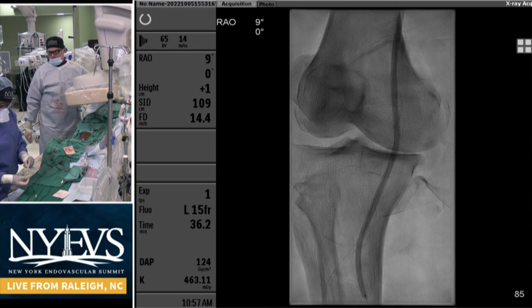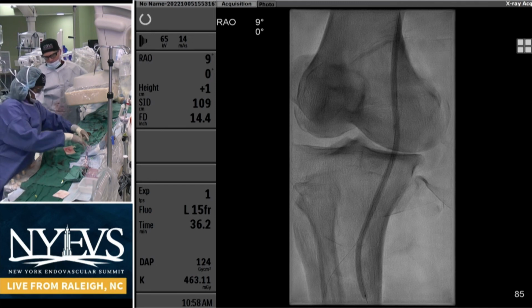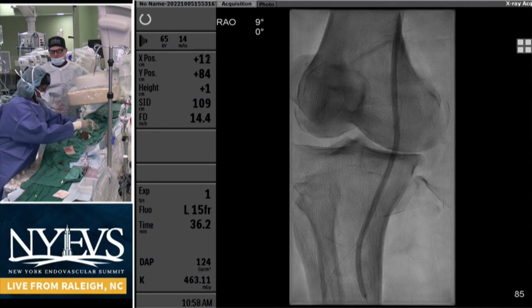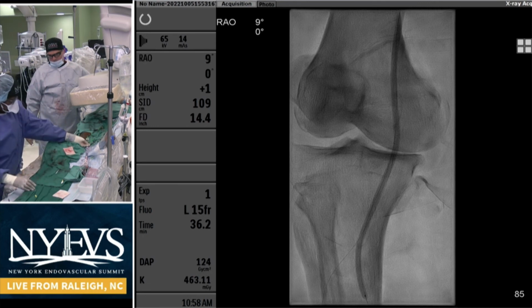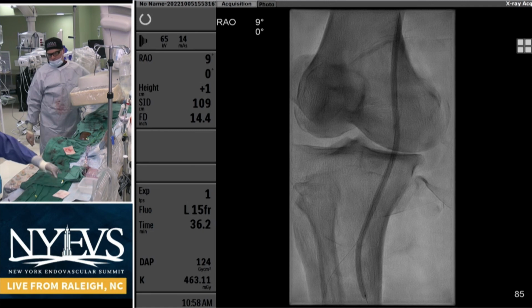re-establishes the whole fact. Just for a final question, when you know you're going to deploy a stent in the AT and the P3 segment, and you have now a big size mismatch, deploying a Supera and let's say a coronary stent, whether it be 3.5, 4.0, 4.5, you can use a Megatron and you can expand your coronaries all the way to 5.0. Yes.